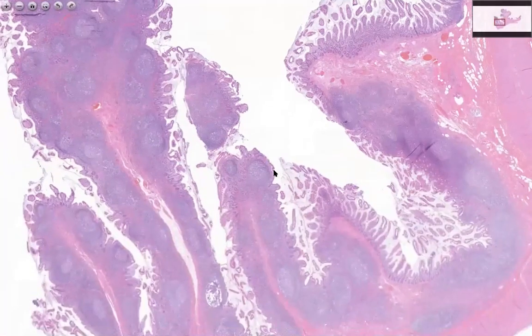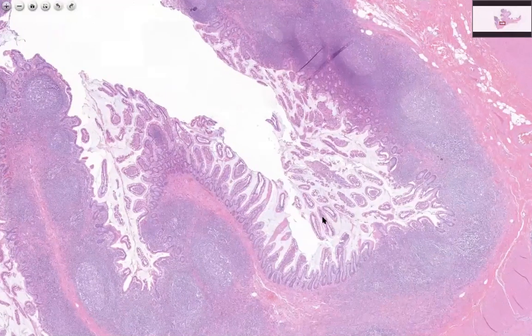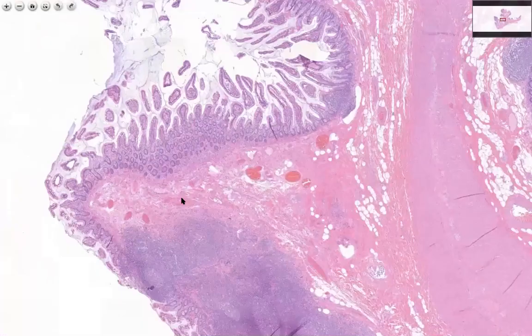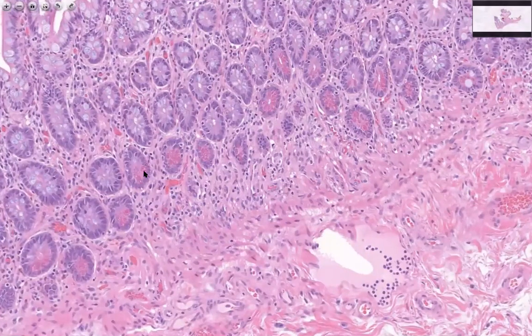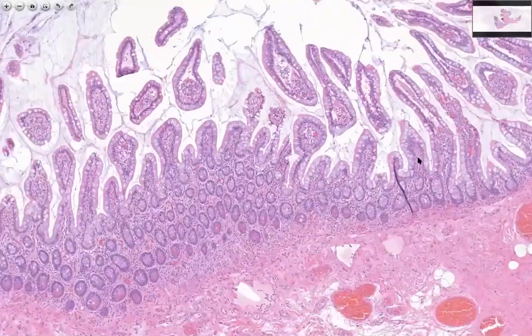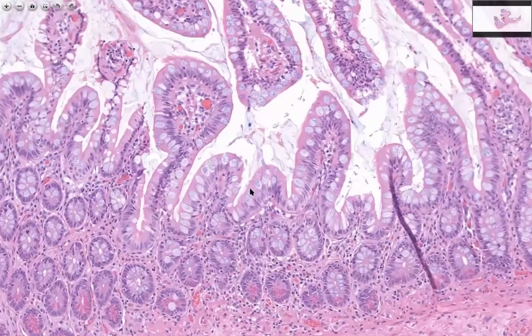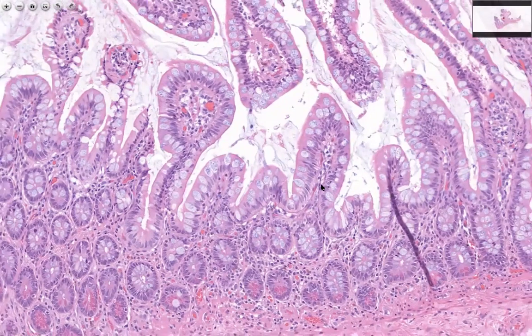The ileum has even longer villi, and so we see a lot of these floating villi, and that's because they're so long that we just tend to get a lot of it in cross-section when cutting it, and we can't get it all in one profile. Again, we have the Peyer's patches here. In the ileum, we have a lot of Paneth cells, all of these cells with very large reddish granules. And we even have more secretory goblet cells here. So you can see that the proportion of goblet cells to the pink enterocytes has increased.